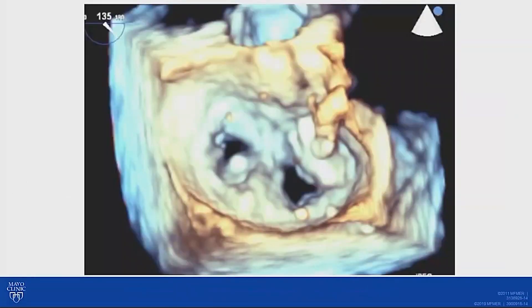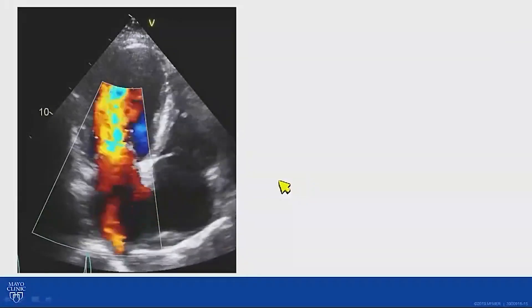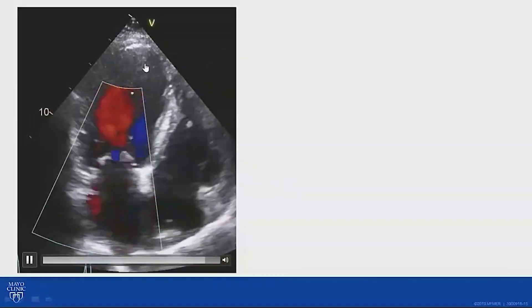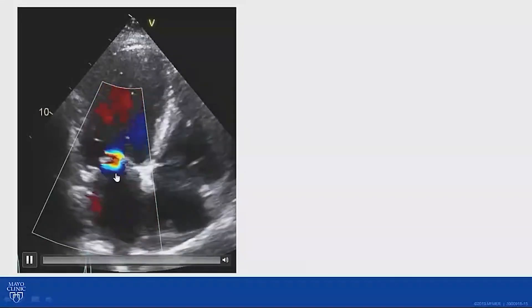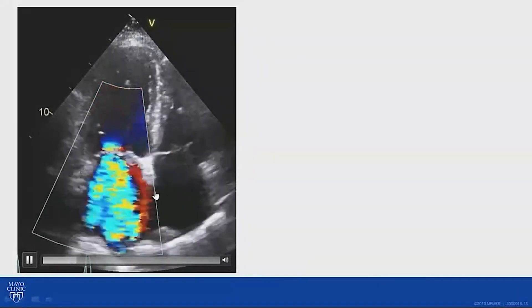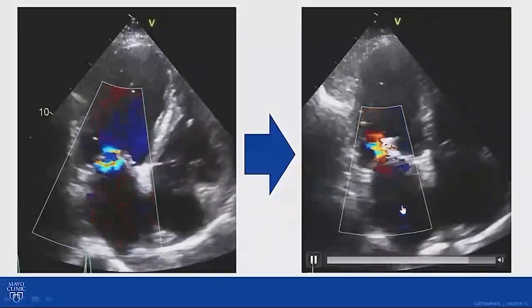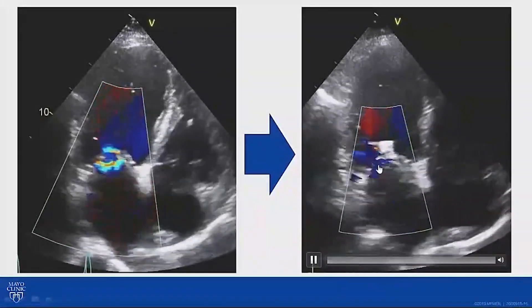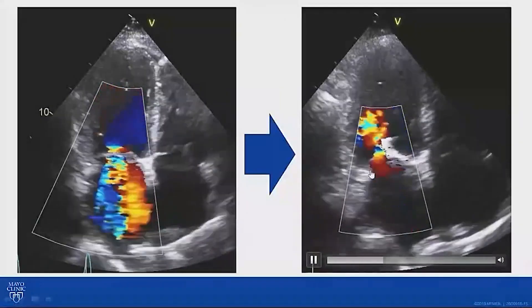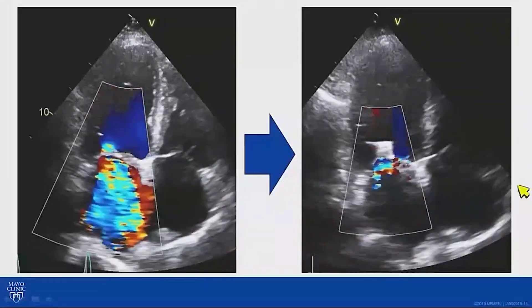Looking at a clipped valve on 3D, we do create a very similar double orifice structure. This is our patient before the clip — you can see the color illustrating severe mitral regurgitation going back towards the left atrium in the apical four-chamber view. After placement — in fact two clips were placed — we have a small amount of residual regurgitation, and patients tend to feel better.